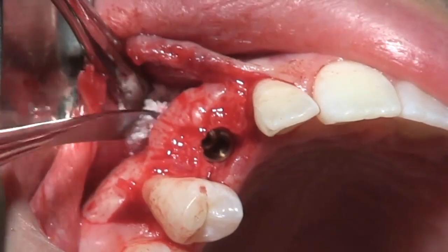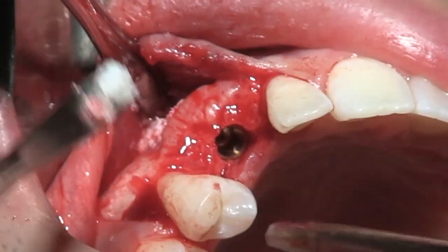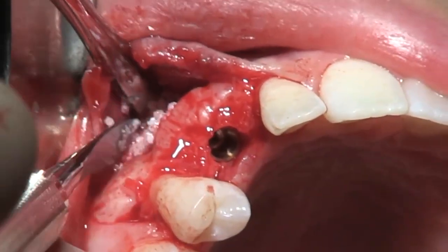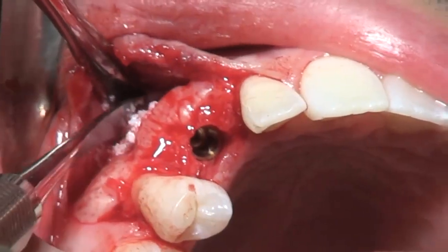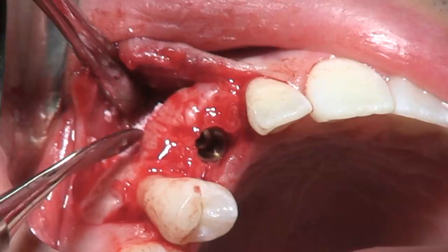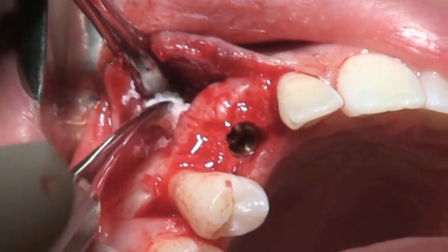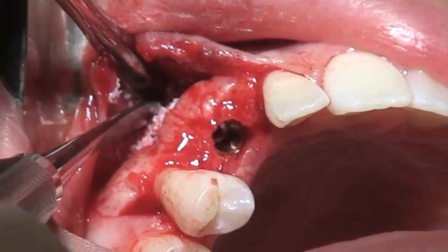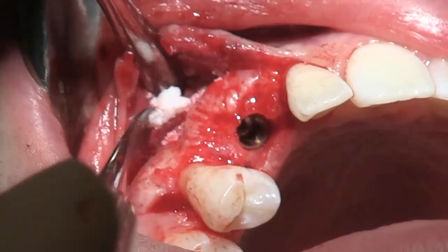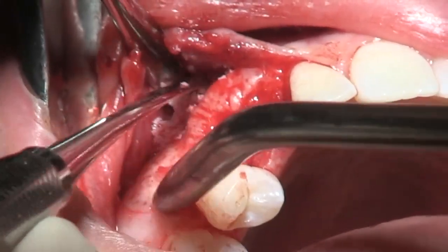Approximately 2 millimeters of buccal bone will be applied on top of the titanium, also allowing a good convexity in this area to counter the bone deficiency in this site. As it was a very moderate defect with only an apical extension, only bone substitute was used in this site.